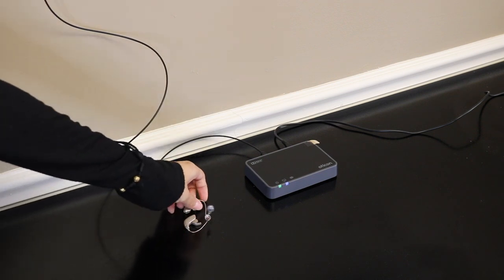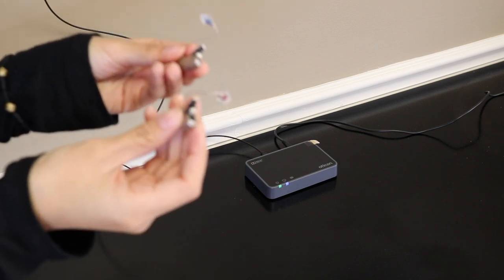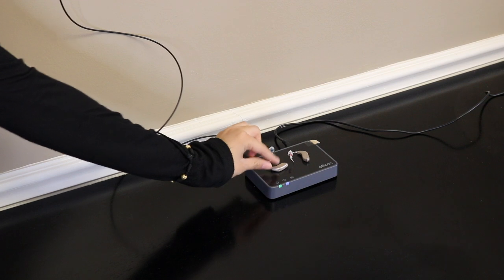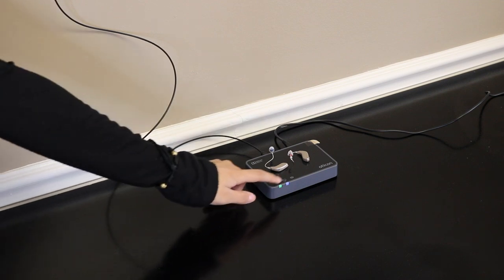The next step is to close both battery doors on your hearing aids and set them on top of the adapter and wait for them to connect. You will know that they are connected when both lights are blue.